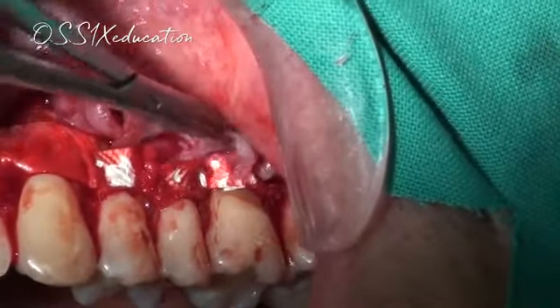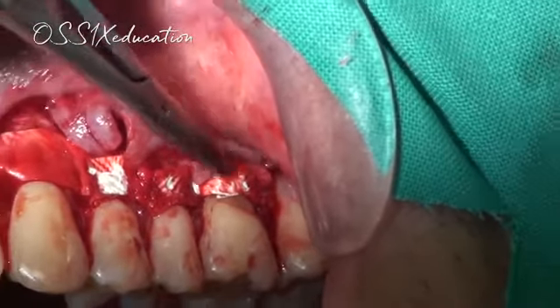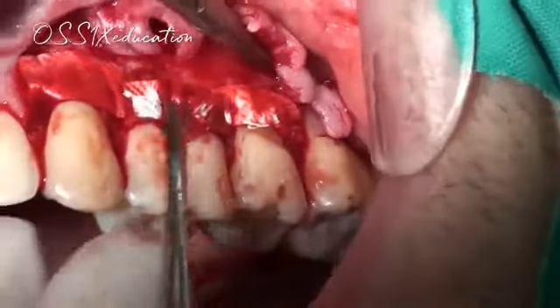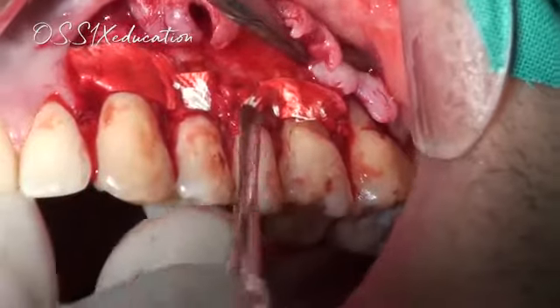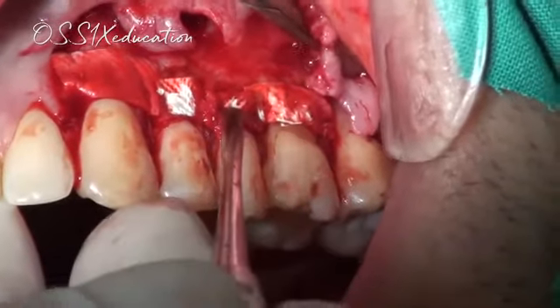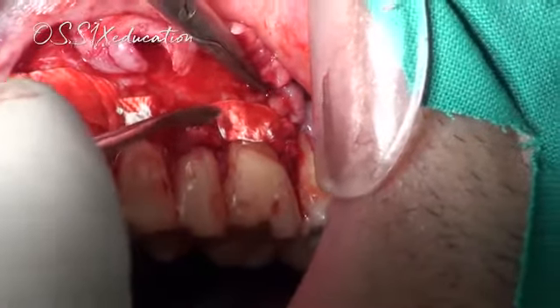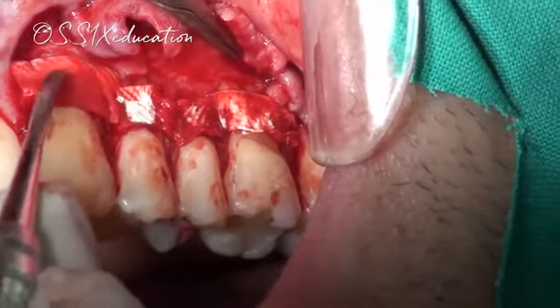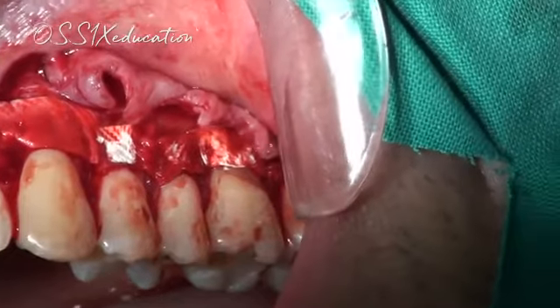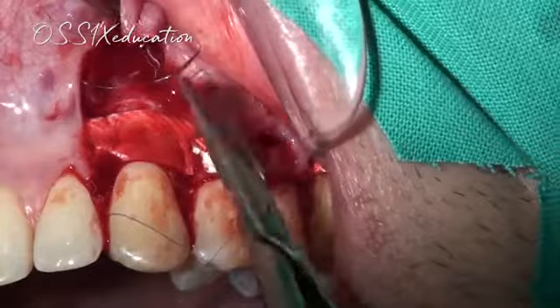Okay, so what we can see here is that this is really nicely stabilized. And I want to show you something. Look how stable the material is. Here it's not, here we're going to stabilize it with an additional suture. But look at this, look how stable it is. And now what I like to do is stabilize the graft.